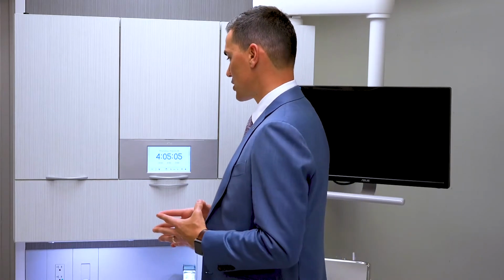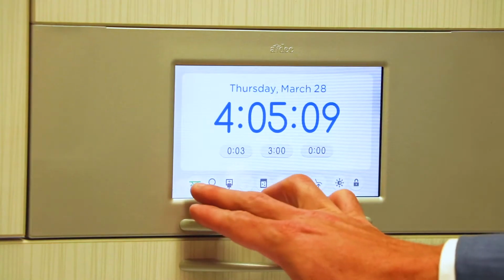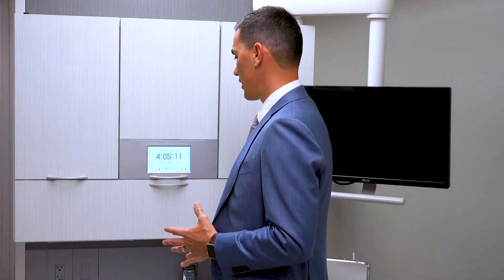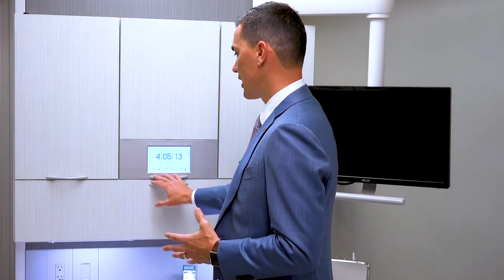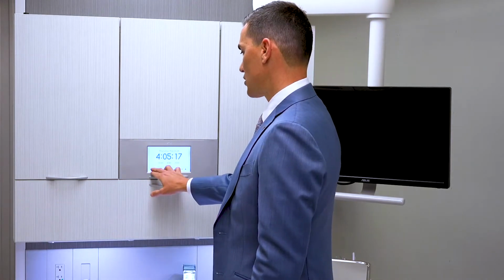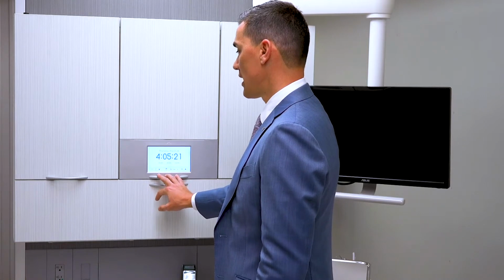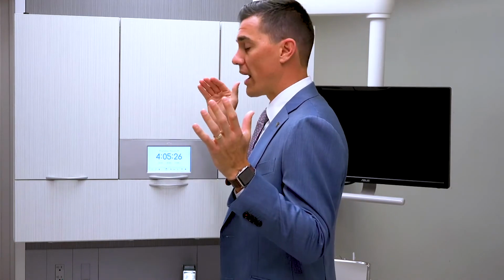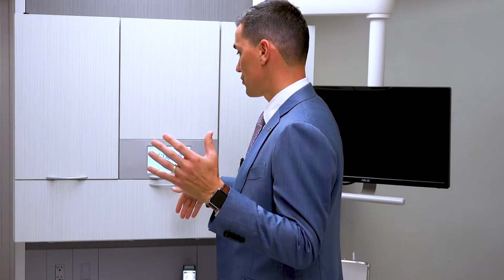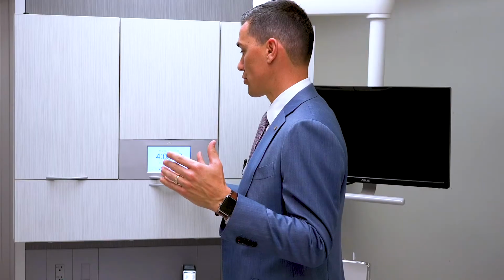As we look at the touchpad, the control center itself, we have the ability to turn the undermount LED lights on and off, as well as surrounding cabinetry lights if needed. We can turn that on and off just by the touch of the button. If we wanted to have the ambient light turned on and off, we could actually wire low voltage through to the distribution box, and we could press this button and that would allow lights to turn on and off.